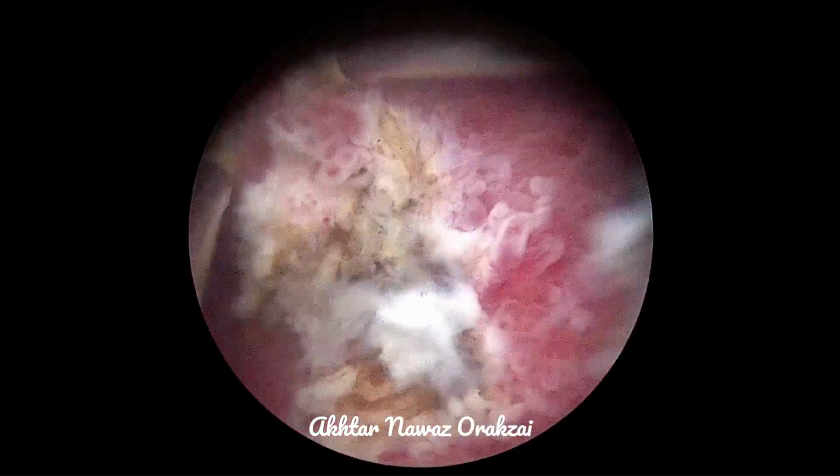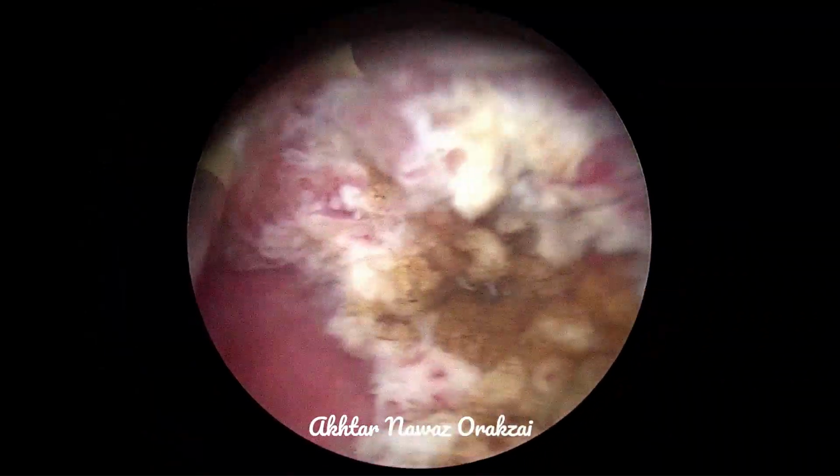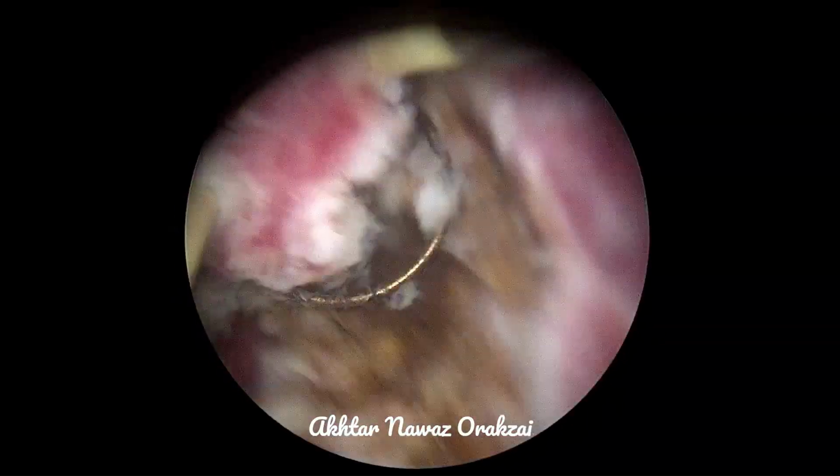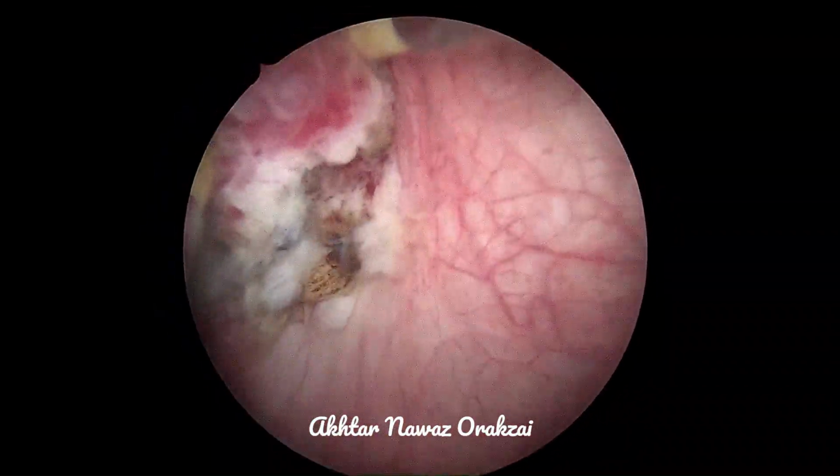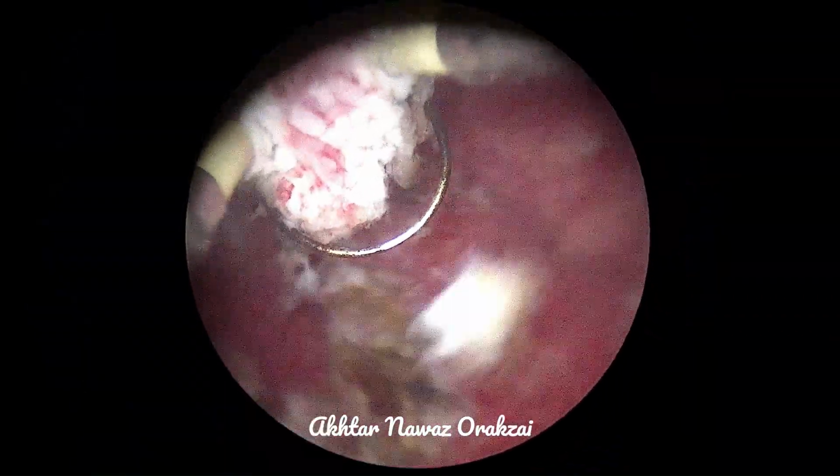These educational videos are not advanced videos. These are just educational videos for the beginners and new learners and trainees. That's why we discuss and perform the basic procedures.